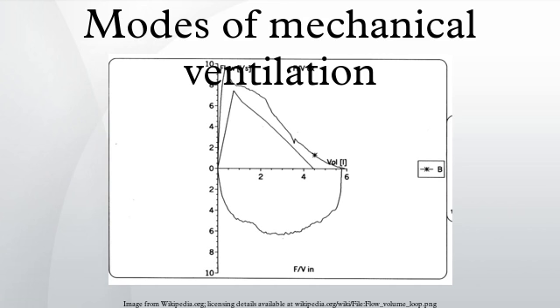Proportional assist ventilation. Proportional assist ventilation is a mode in which the ventilator guarantees the percentage of work regardless of changes in pulmonary compliance and resistance. The ventilator varies the tidal volume and pressure based on the patient's work of breathing. The amount it delivers is proportional to the percentage of assistance it is set to give. PAV, like NAVA, supports both resistive and elastic work of breathing in proportion to the patient's inspiratory effort.